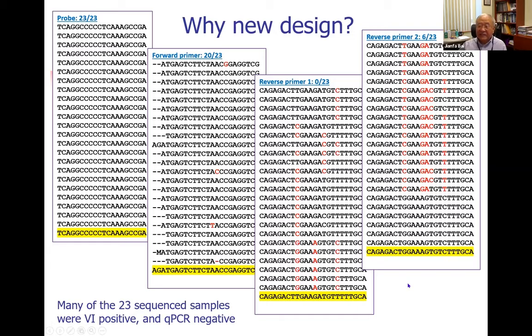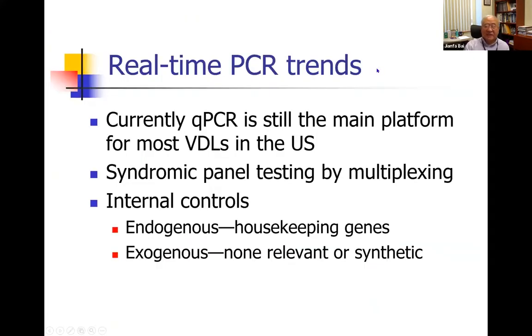A few years later, new strains emerge, and then your assay is no longer covering the new strains. So it's a continuous process for molecular assay design and monitoring. It's not a one-time deal. So that's why we just do stuff ourselves.